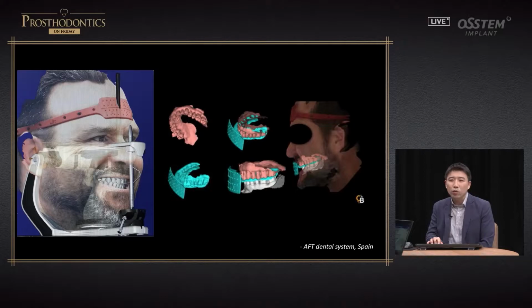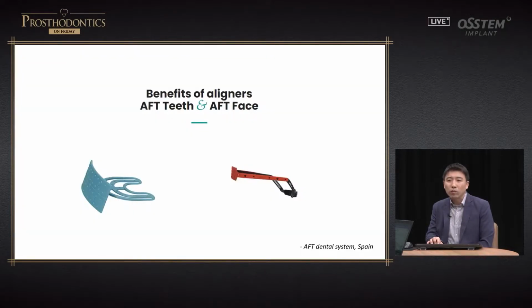This is something that is commercialized by a certain company. You can have a landmark on top of your head like a headband, and on dentition you can have the patient bite on a jig to get a silicone bite and do scanning. If you scan the jig bite, facial scan data and model scan data, you can merge it well. These are utilized frequently. As mentioned, this is a commercialized product.